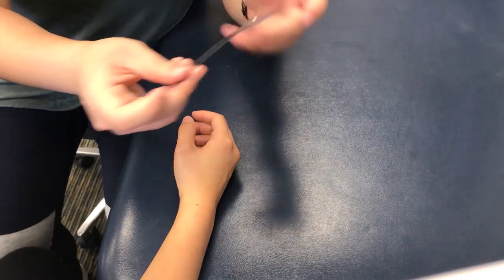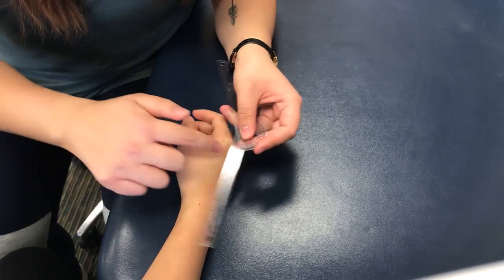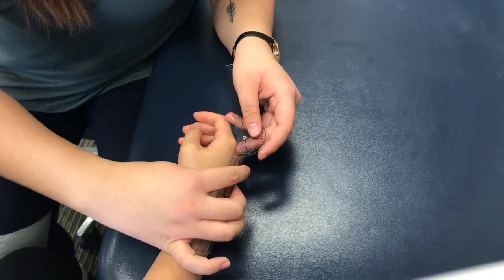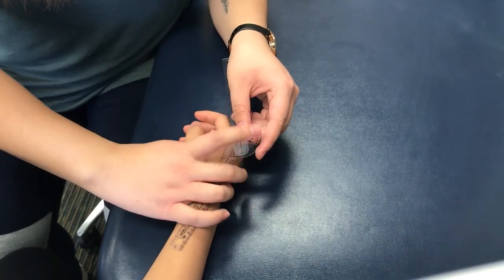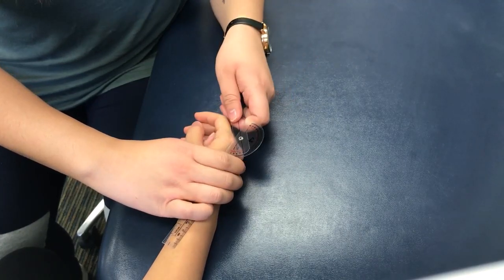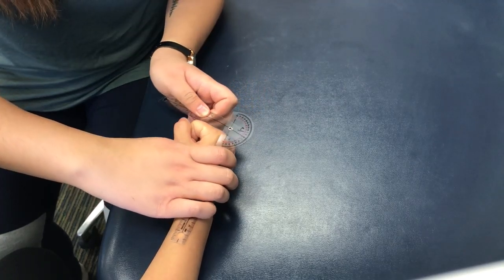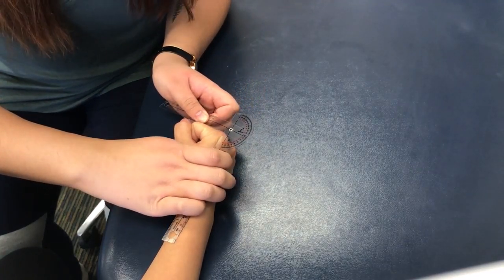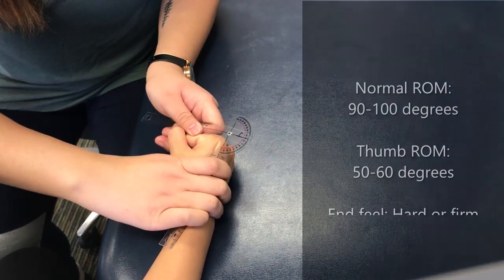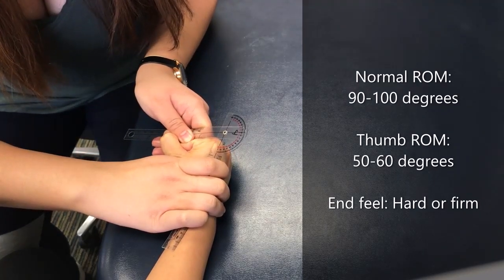So I'll place the axis on the dorsal side of your MCP joint, and the stable arm is going to go along the metacarpal, which you'll palpate. And then I'm going to go ahead and hold it stable here, and then the distal arm is going to follow the dorsal side of the proximal phalanx. So go ahead and make a fist, and I'll get an active range of motion measurement. And I got 85, and then to get passive range of motion, I'm going to push further. Now I'm getting 100.